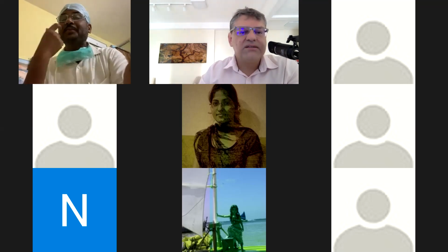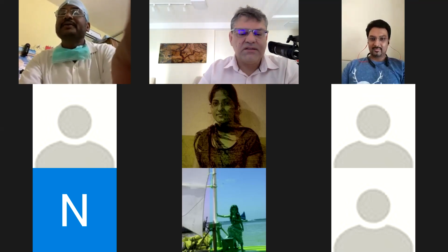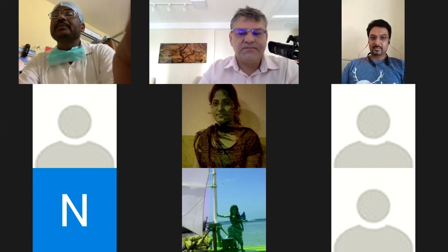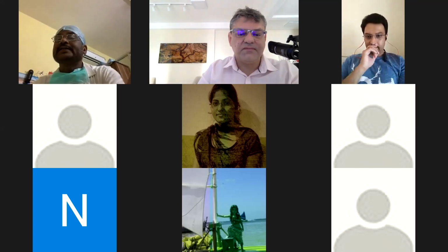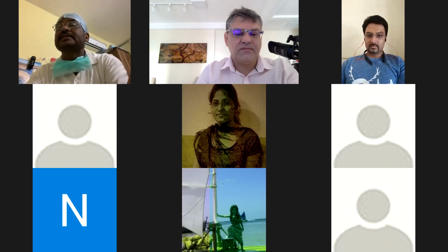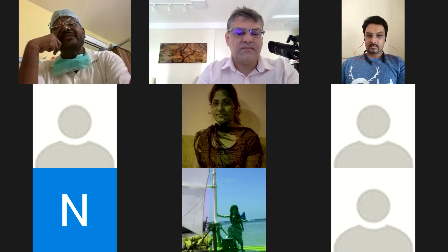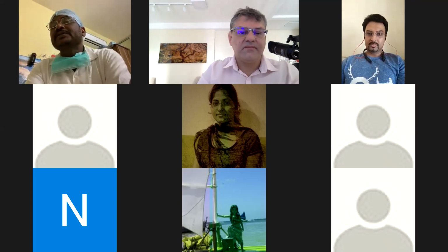Nice presentation by Pooja. One thing I would say: this window defect is actually transmitted hyperfluorescence. Usually it happens because of any defect in the RPE. So RPE atrophy, which is the accentuation of the choroidal fluorescence. That is what you mean to say.